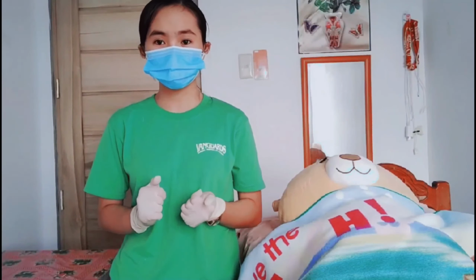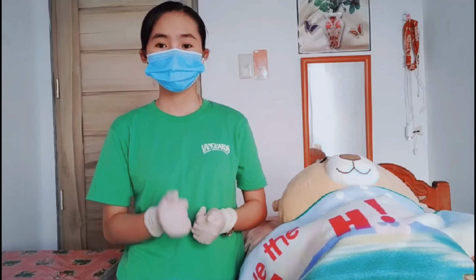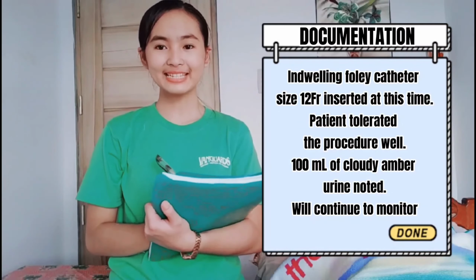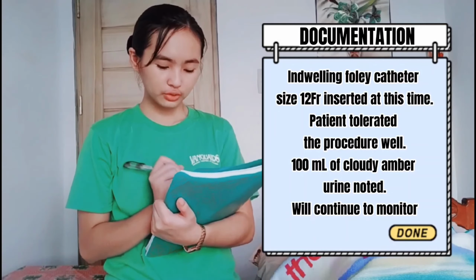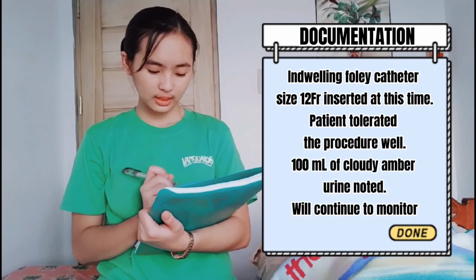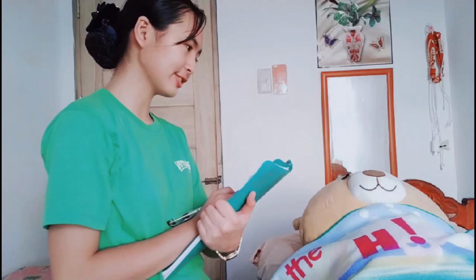After removing the catheter from the patient, we are going to perform perineal care to maintain the hygiene of the patient, and I'm also going to perform hand washing again. Lastly is the documentation. Indwelling Foley catheter size 12 French inserted at this time. Patient tolerated the procedure well. 100 ml of cloudy amber urine noted. I'm going to continue to monitor. Okay, ma'am, thank you for your cooperation. Have a good day.